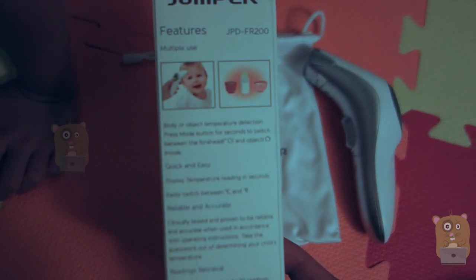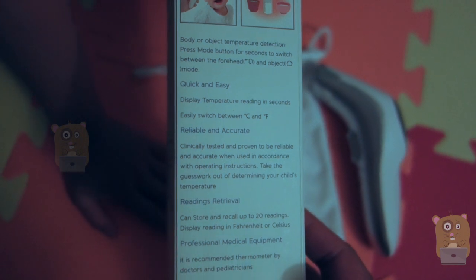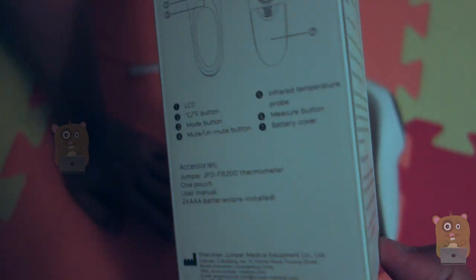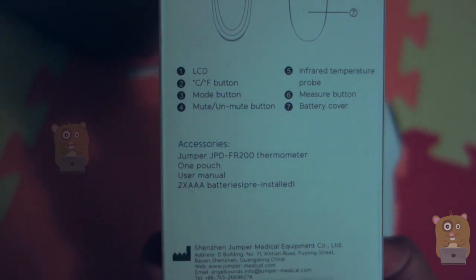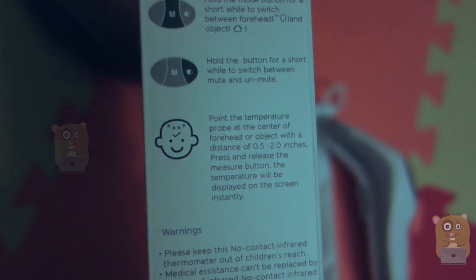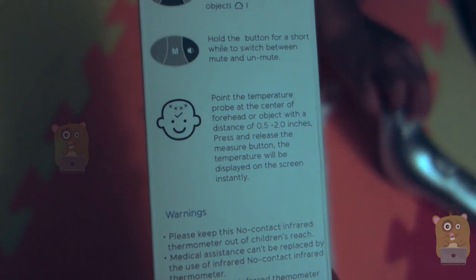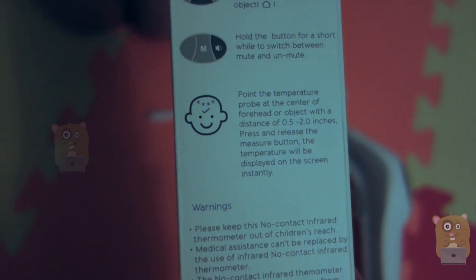I just want to show some of the specs for this unit. Some features: it can measure in Celsius or Fahrenheit, and it can measure body temperature or surface temperature. It also came with two AAA batteries to power the unit. Here's some of the features for it. To measure accurately, you've got to hold it between 0.5 to 2 inches from the surface.